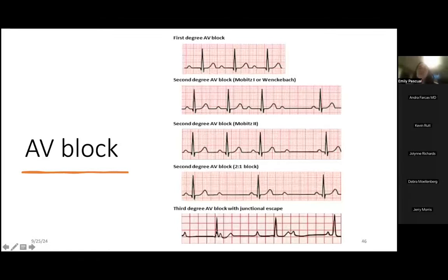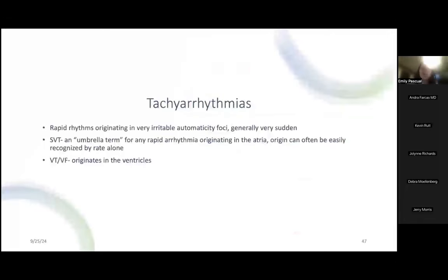And so you can see here the ventricular rhythm. This is probably a junctional escape. So most patients have some ventricular escape, even in complete heart block. And you'll see rates really anywhere from 20s to sometimes as robust as like the 60s. But again, if you see that, the patient definitely needs to come to the hospital for sure.